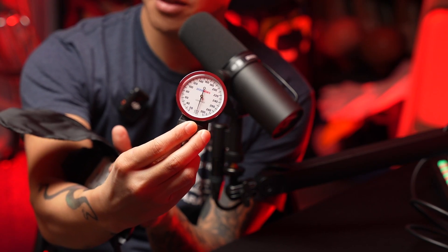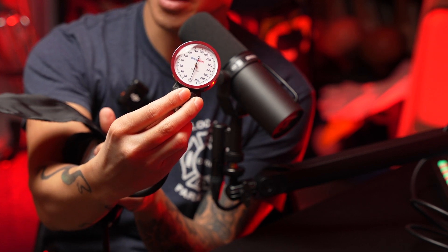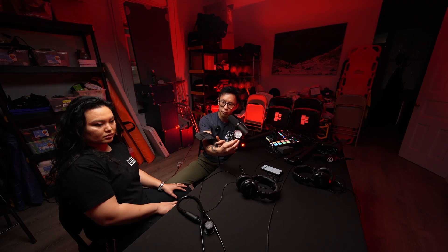To start off, we want to ensure that our sphygmomanometer is on zero — that the dial is on zero, and that means it's centered. If it's off zero, then you're going to need another blood pressure cuff.